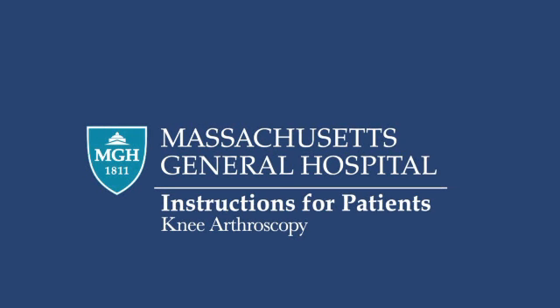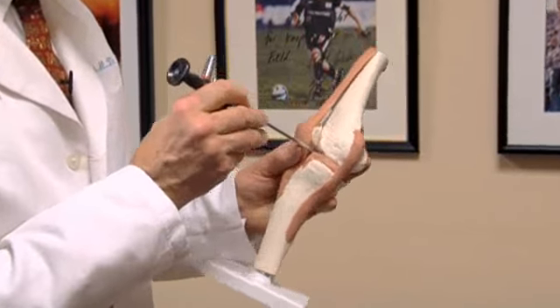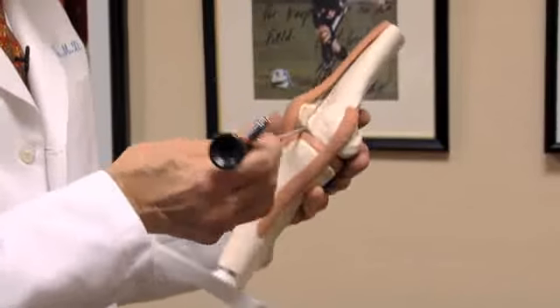The purpose of this video presentation is to inform you about arthroscopy and arthroscopic surgery, its benefits and risks, and potential complications. You will now see a video that contains information you need to know for your knee arthroscopy. This is an arthroscope. It is an instrument that allows us to look directly into the knee joint.